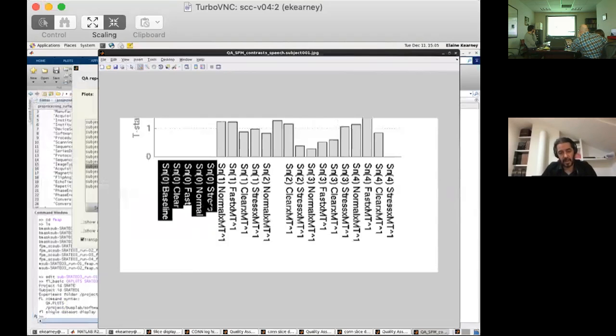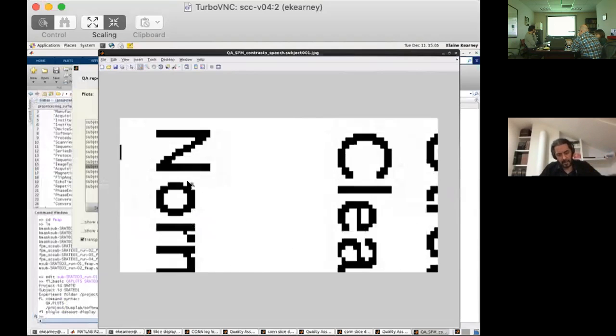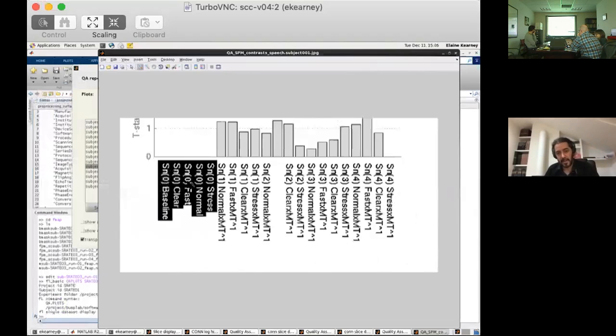If you had some data that had this signal-to-noise ratio, what is the power or sensitivity that you're going to have to detect something on that data? But it's not actually looking at the data. It's all information that has to do with the design, how the design information is encoded. The only thing that is related to the data is some of the parameters in the design matrix, like the motion parameters, which are actually obtained from the data.